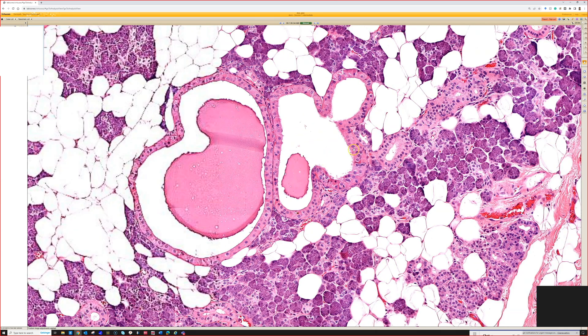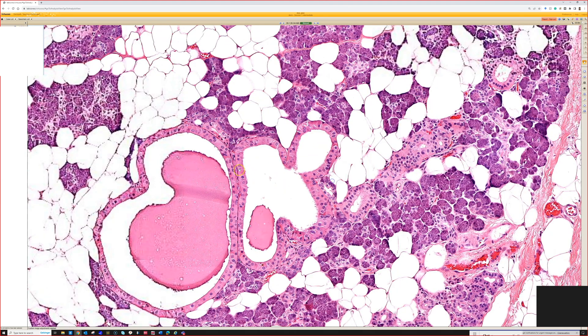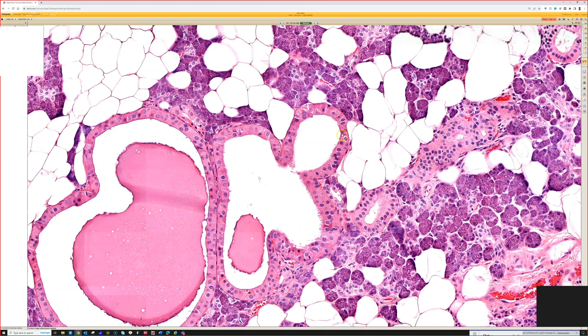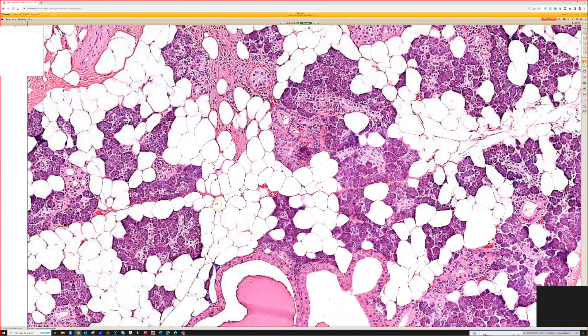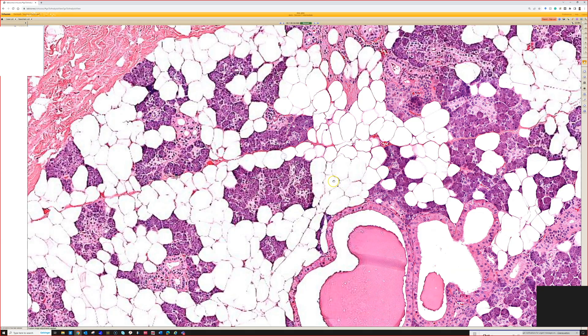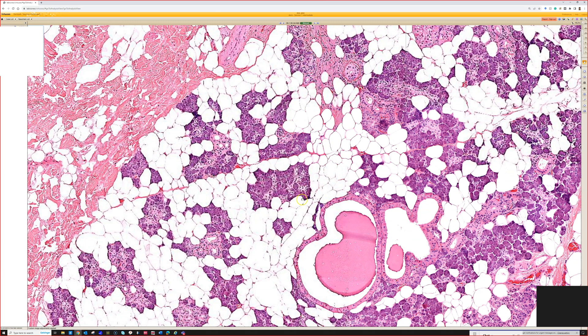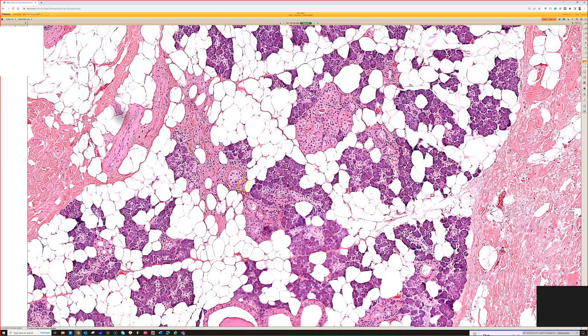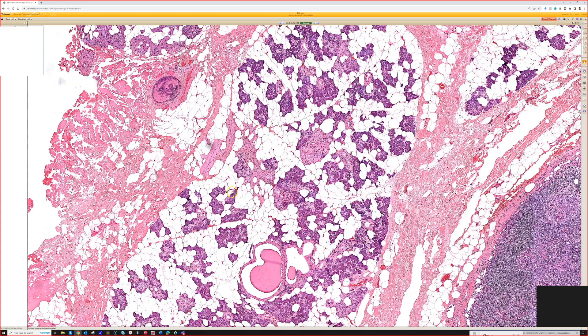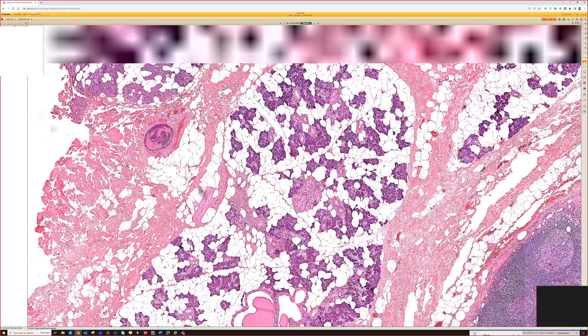And they have some cystic change like this. These have some oncocytic kind of change to them. There are ducts right here. And then the tissue looks similar to exocrine pancreas, except that there's a lot of fat mixed in with it.